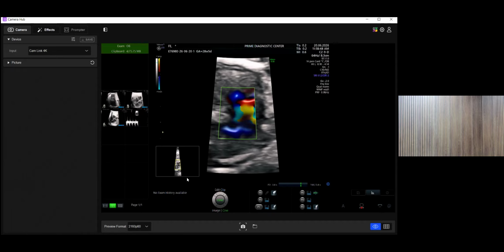Many of us think that adult echo is just looking for chamber size, regurgitations, and ejection fractions, but that's not true. A lot of development has happened in adult echo, and keeping updated on that is also challenging. The challenge in fetal echo is the size. Because of poor azimuthal or depth resolution, you get superimposition of the structures which are posterior and anterior.